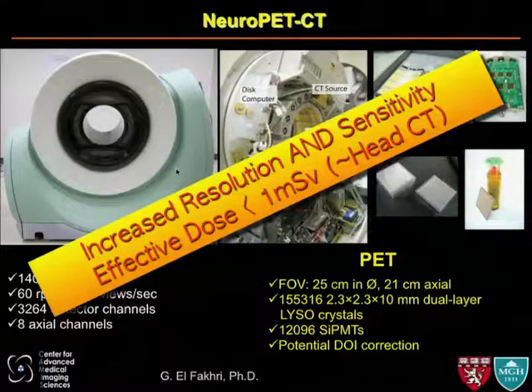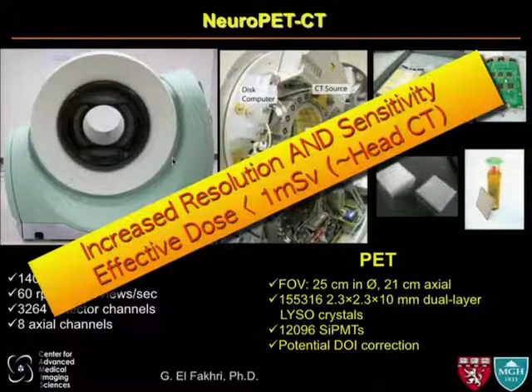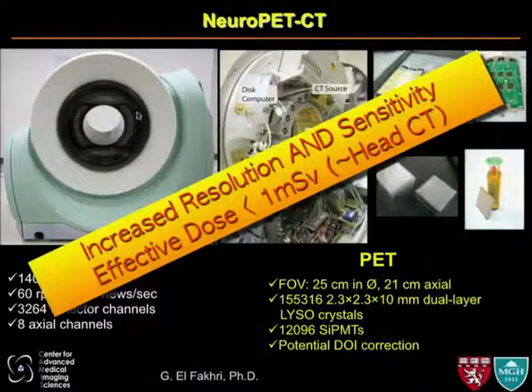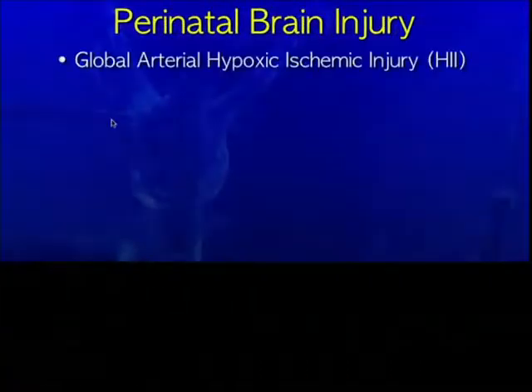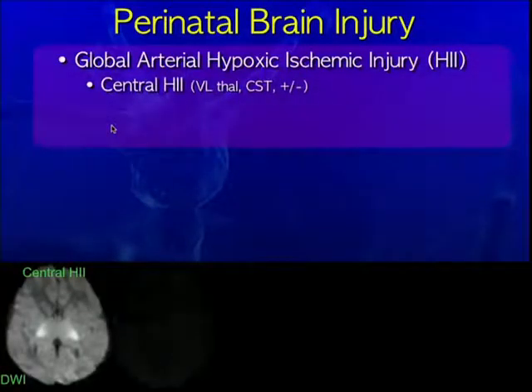This is a system that's been developed at MGH. We've been approached by another vendor to think about some technology advancement in this area, and I think it's a really interesting thing to shrink the size of these PET cameras to use in our babies so we can significantly decrease the doses. So I'm going to stop there.